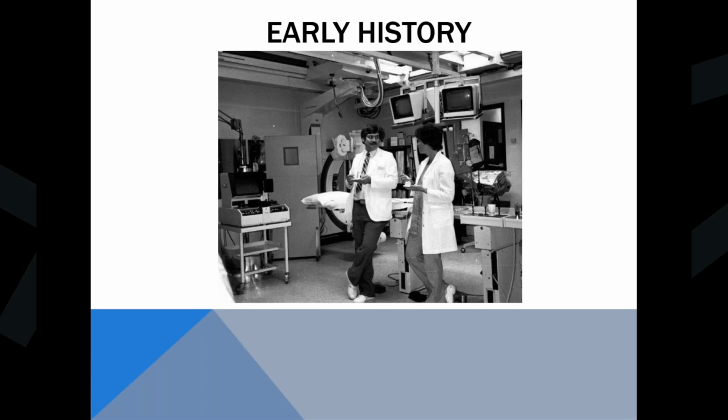Then it's not in the picture. They would have a special film developer that you would put the film in, and then this rather lovely piece of equipment here is where you'd view it on. Now, again, you would think this technology, I mean, this was probably late 1970s. I actually had to still work on these. Some of the older cardiologists wanted to see their old films from 20 years before. Well, no one knew how to run this thing, so I would have to spool it up.